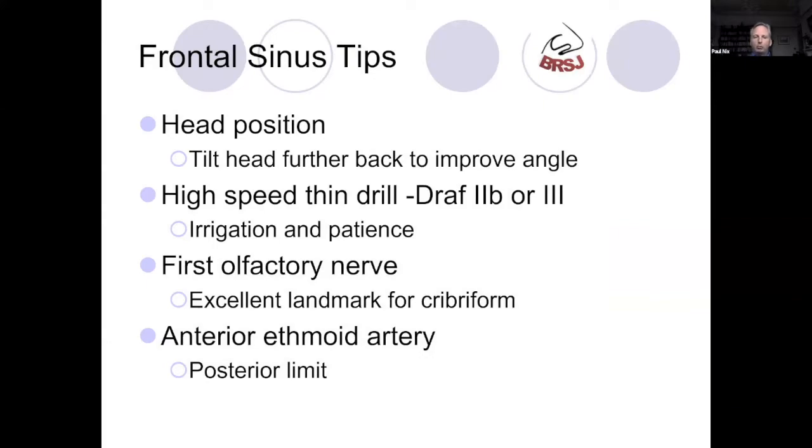If I'm having to do more, and that means I'm going to have to use a drill, again, the head position is important. But having access to a drill that's thin and has high speed, and having lots of irrigation and plenty of patience, is really an essential step. And I have to say, whenever I use a drill in the frontal recess, I'm either going to be doing a Draf IIB or a Draf III.